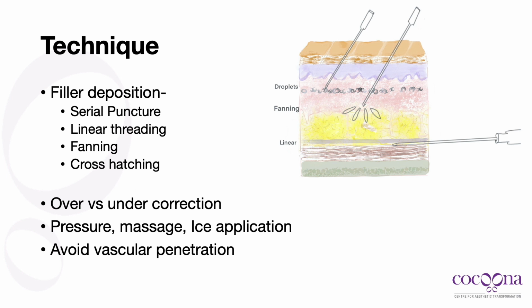Pressure is applied after the injection to prevent bruising. Massage should be gentle, only if you want to displace the filler. Otherwise, excessive massage can displace the filler significantly. Ice application is important to prevent bruising. Avoid vascular penetration, and I will show you the technique while injecting fillers how to do that.